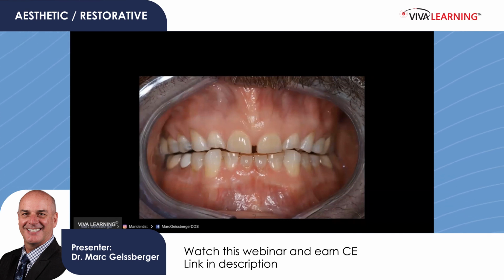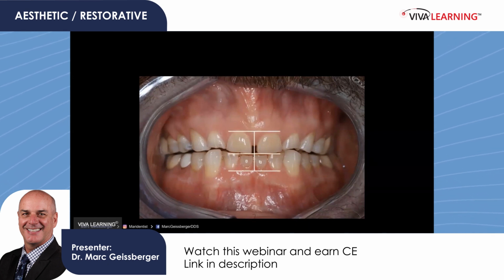And if I intend to wax this and design this, I want to do that in CR. Now, when I keep his jaw in a position that allows me to open him slowly without allowing the mandible to translate, we'll see some interesting changes.